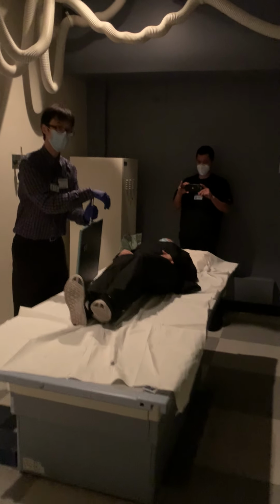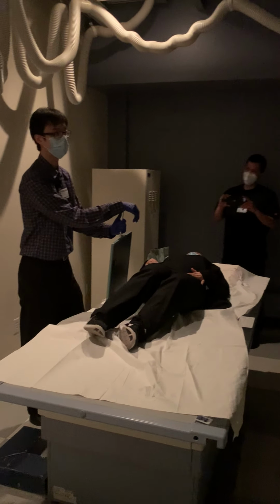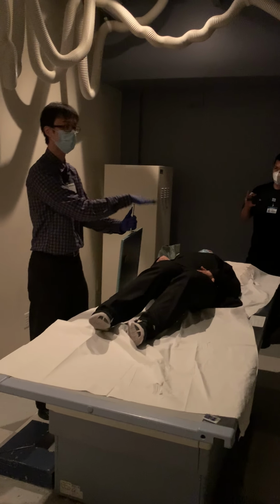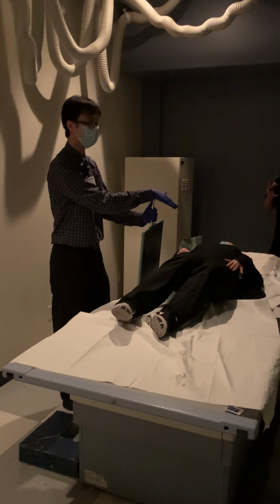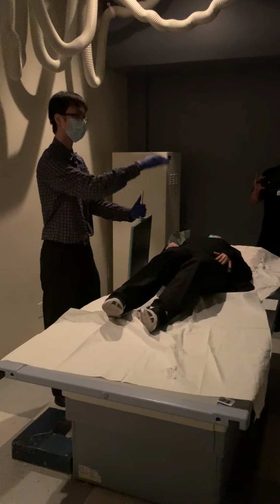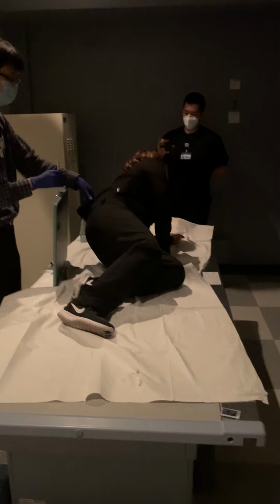Abdomen. Okay? Where have you heard the term lateral decubitus before? On the chest. We are doing this almost exactly the same. Main difference is SID. Is that 72 inches? We're at 40 inches. So, first step, turn onto your side, please. This will be the left lateral decubitus.